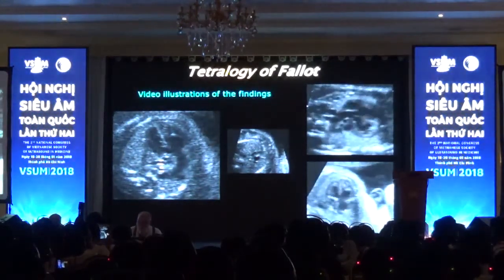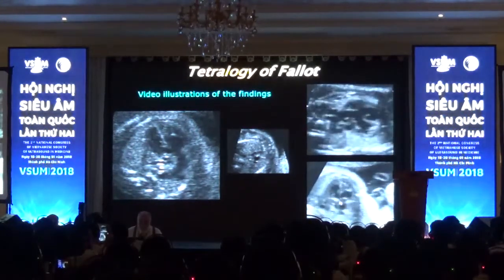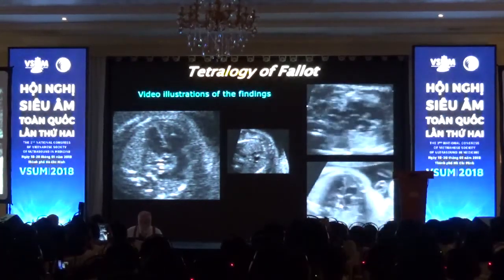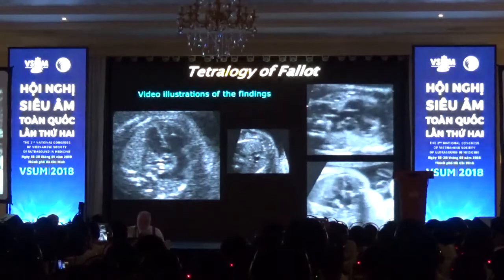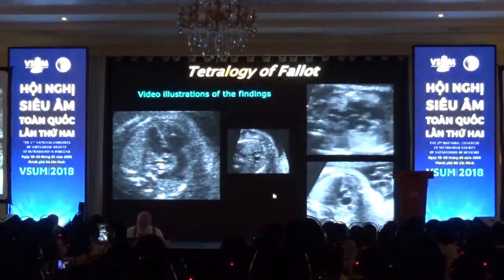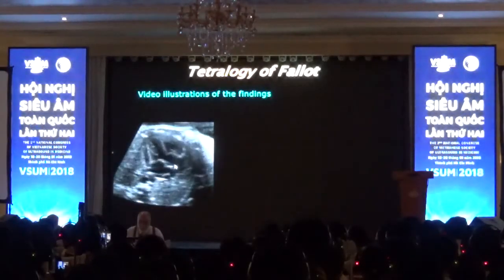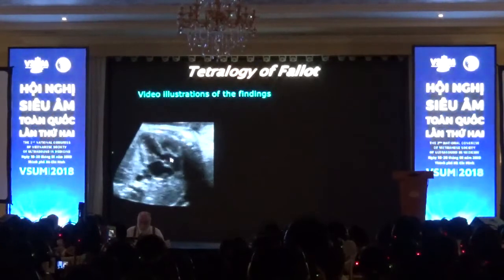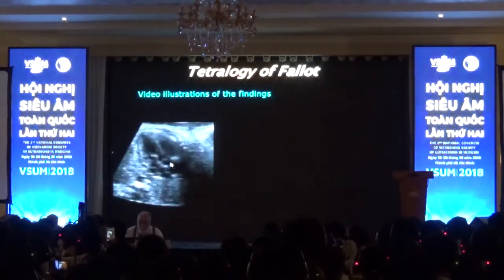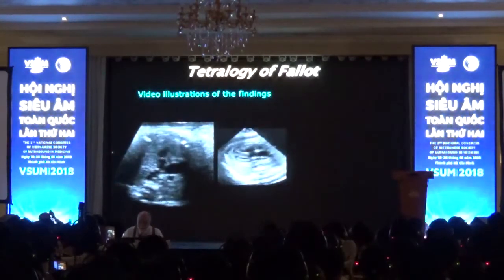Here, what do you think about the aortic valve? Is this aortic valve preventing regurgitation or not? Not at all. This aortic valve is just floating in the flow, just like seaweed in the ocean. Okay, so this is an incompetent aortic valve. Four-chamber view looks pretty normal, just a small defect over here, and you see the ballerina leg here is abnormal. It has a kink at this level, and we have overriding of the aorta.